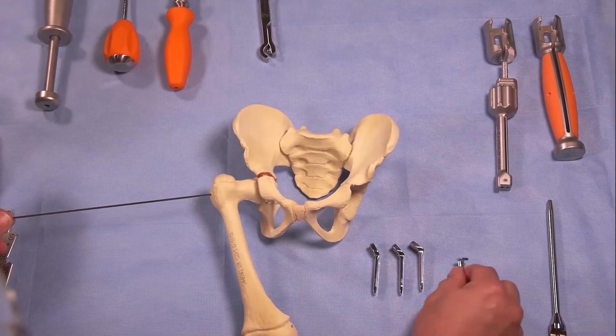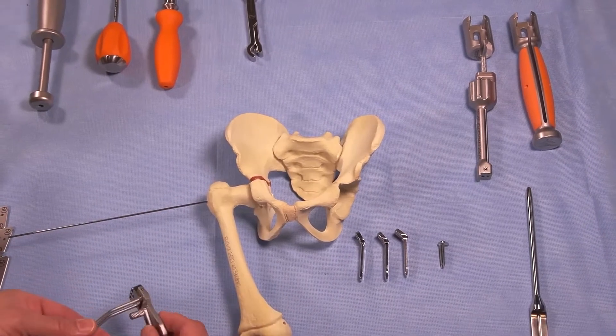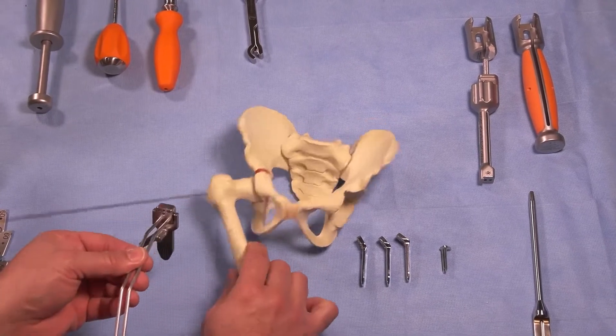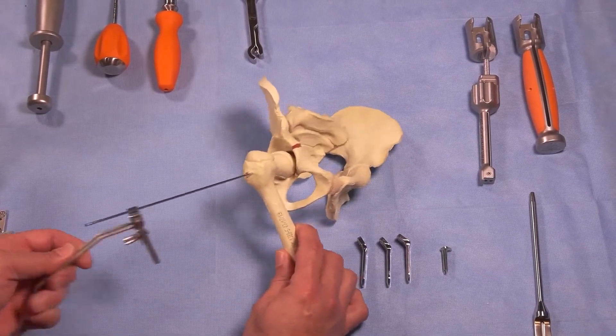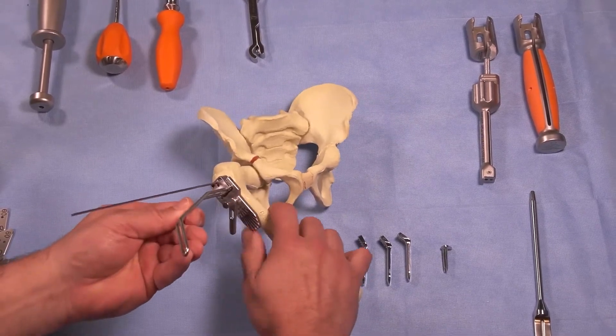This is much different than the fixed angled blade plates. The next step is to break the cortex with the cortex breaker. This cortex breaker slides over your guide wire, and you use your drill to break the cortex.